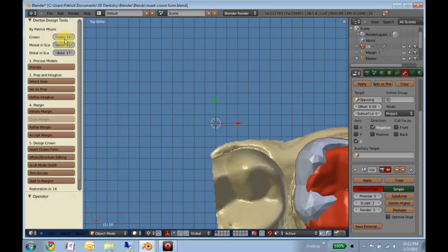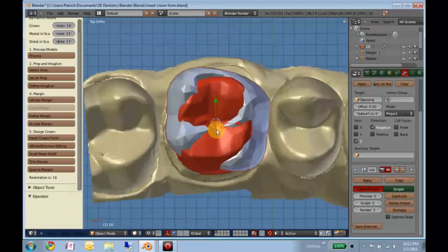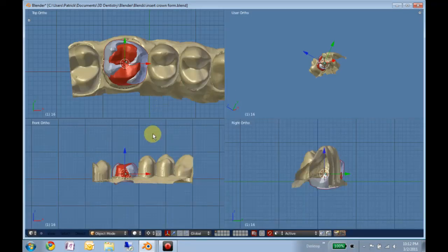And this is in the quadrant system, so 1-6 is the first molar in the first quadrant. So wherever the 3D cursor was is where this crown form will pop in. And this is where I like to use this other view here. Turn off the magnet, and in each of these views, if you grab and move this, it's only going to move in the plane that you're looking in. So here it'll move it in XZ, here in XY, etc.